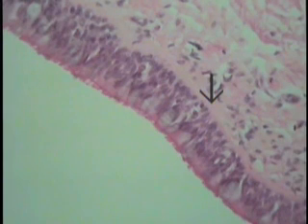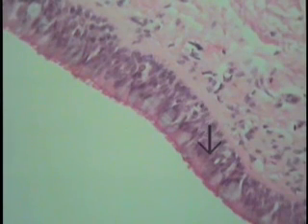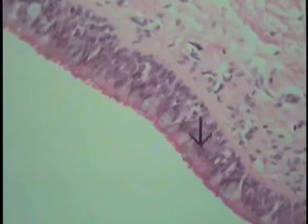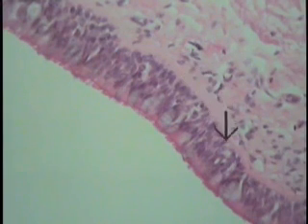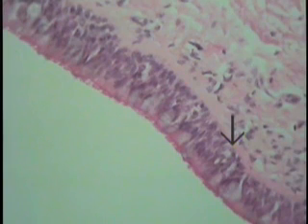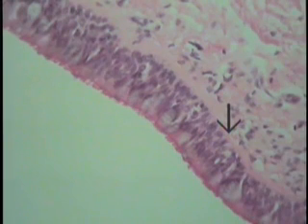Therefore, it is indeed a simple form of epithelium, but because it was confusing to the initial investigators who developed the classification scheme, before it was separated and dissected apart, they assumed that this was a stratified form of epithelium. Then, having discovered that indeed all these cells reside on the basement membrane, sending a process down that touches it, they changed the classification scheme to pseudostratified columnar. In other words, a falsely stratified columnar epithelium.